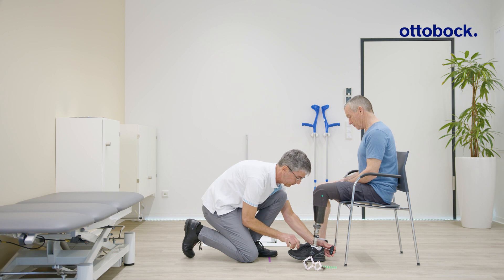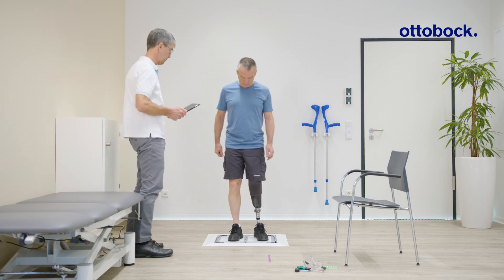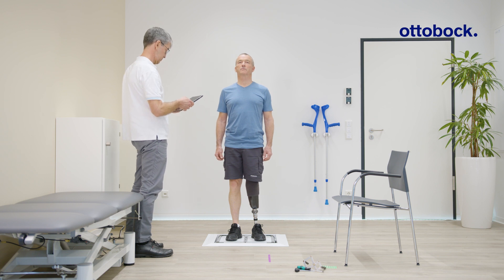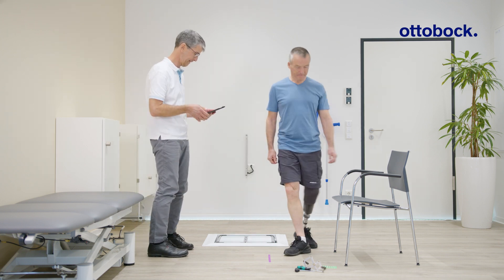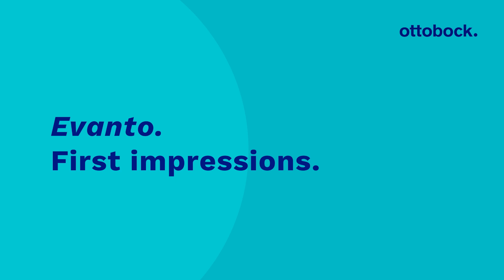Through plantar flexion of the prosthetic foot, the load line is moved to the 15 millimeter mark. Some users may also prefer a more anterior foot position, which reduces the knee flexing effect and gives a more secure initial contact feeling. If the more anterior setting is uncomfortable, then the original setting is correct.